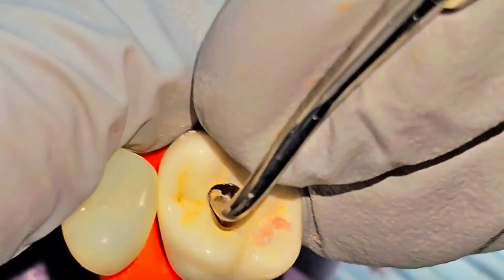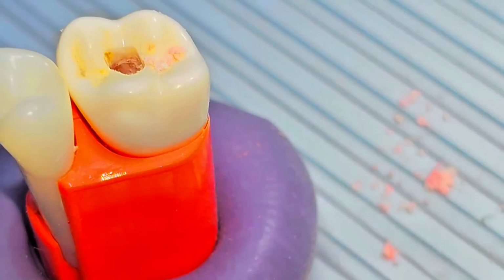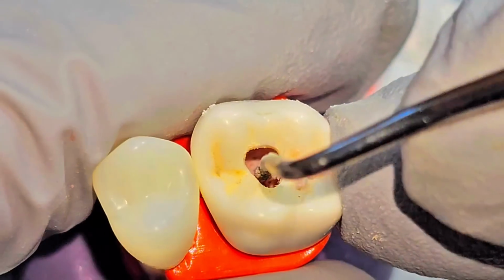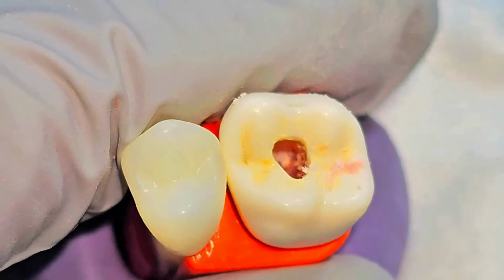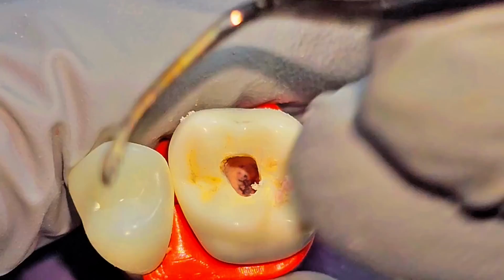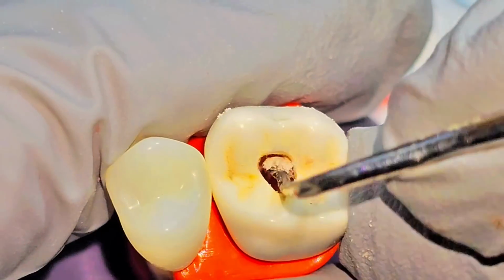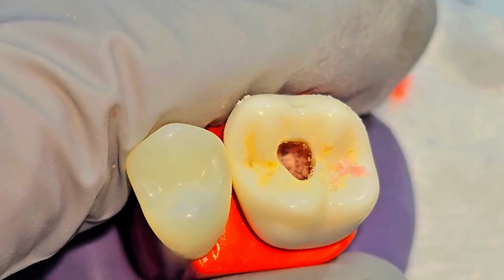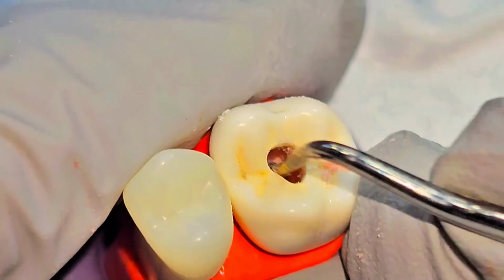We don't want to have a pulp chamber or pulp horn. So the good instrument, of course the explorer is good, but I prefer using the spoon excavator, because the spoon excavator catches the top portion, the roof, the pulp horns.